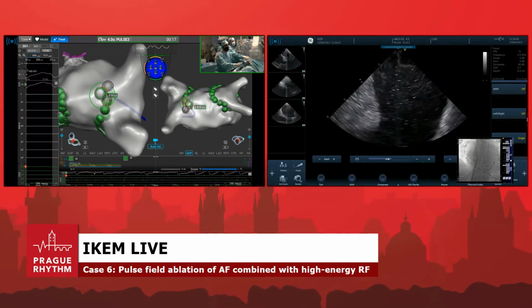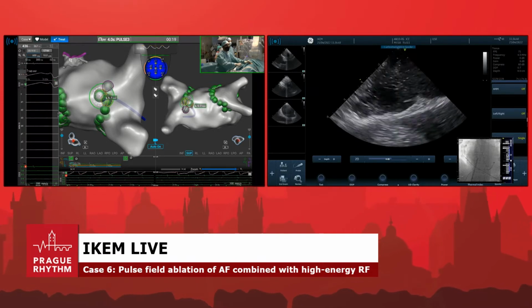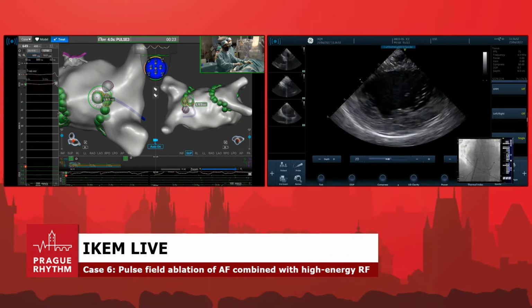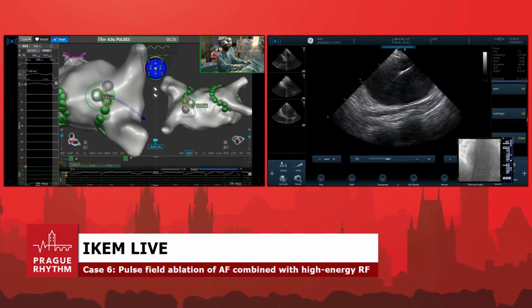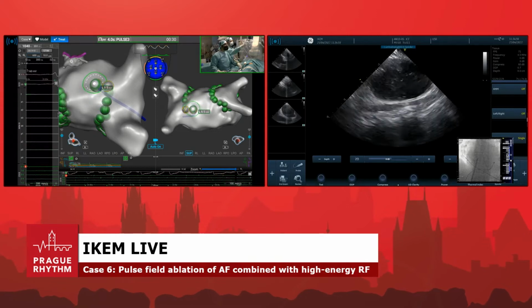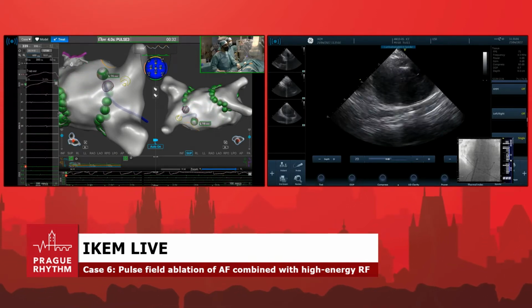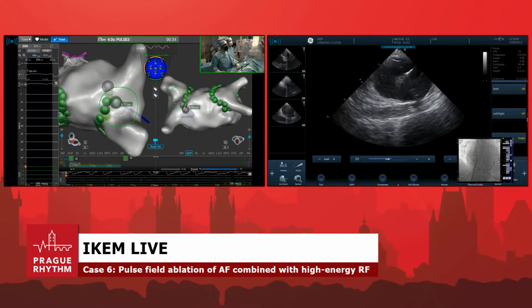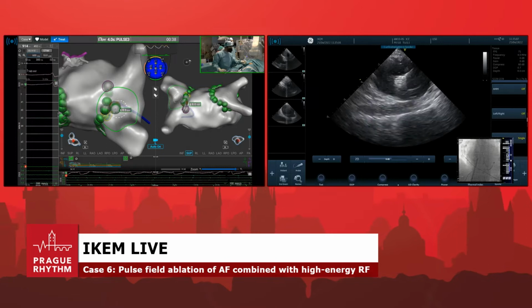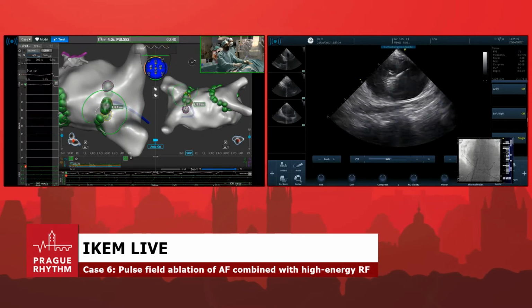See, the ECG is strange. Is that aberrant conduction or was it noise? It was noise. No, it was not. No, it is a VT. And there's a strange ST elevation. Can I see now? We can give atropine. And we have a 12-lead ECG. No, it was an arrhythmia.